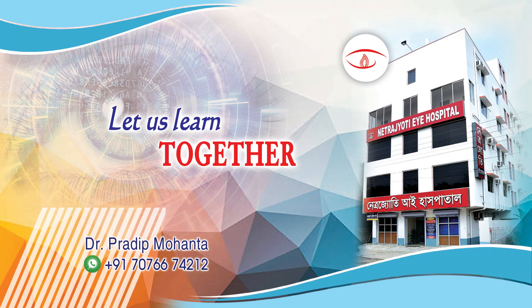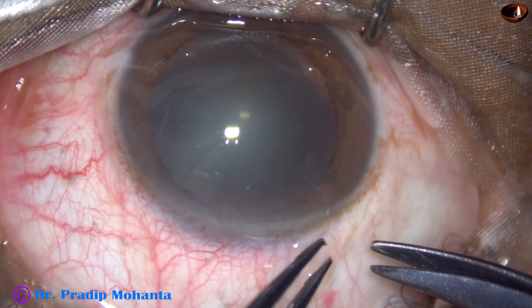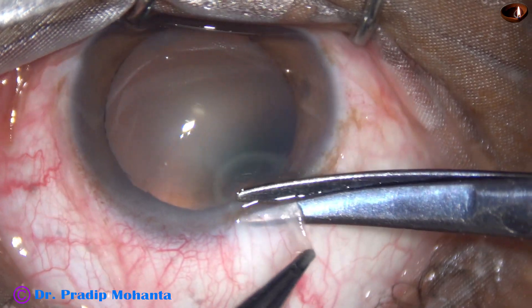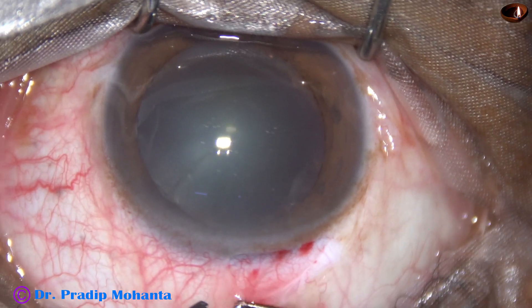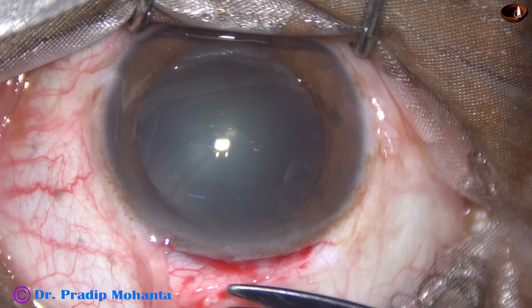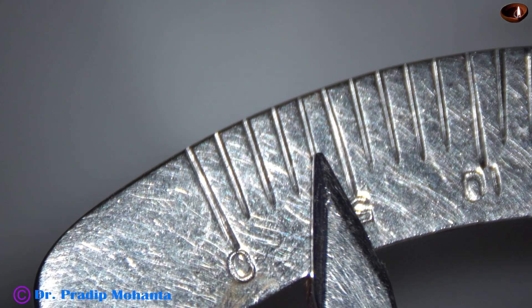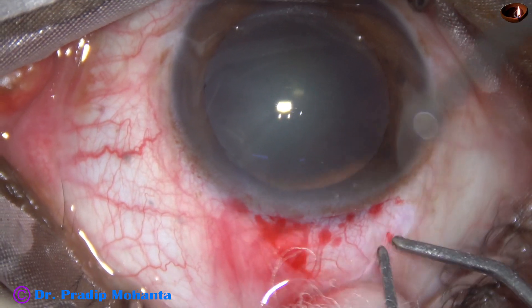Friends, welcome to my workplace at Ranaghat, West Bengal, India. In this video, I am going to show a manual small incision cataract surgery. This is the first time I am trying a pre-chopper in a small incision cataract surgery. My plan is to divide the nucleus into two halves with the help of a pre-chopper designed by Dr. Sohail Irfan Khan. Let us see how it works.